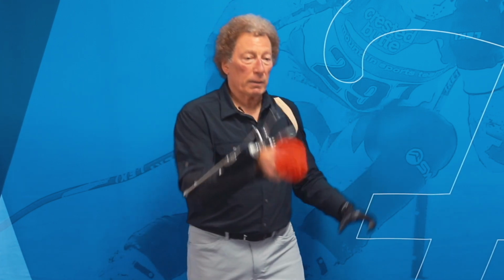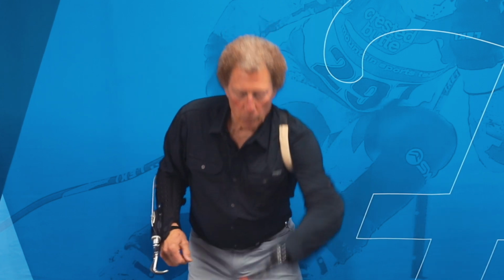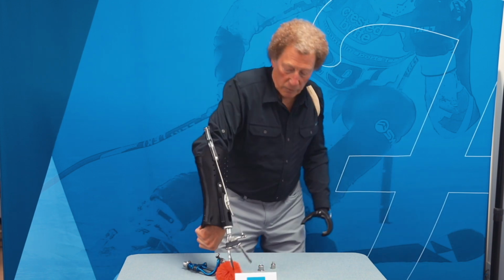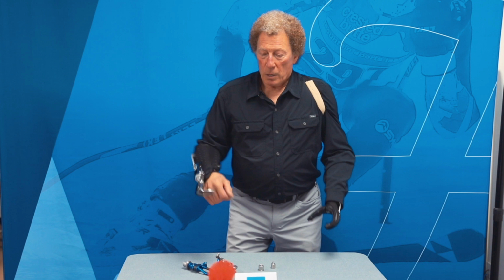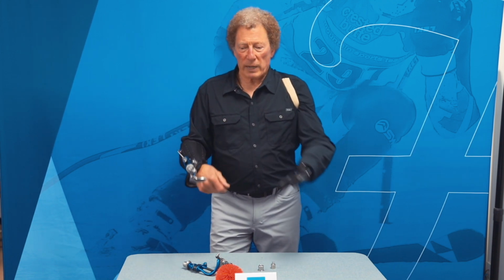It's pretty difficult to do something like this with a split hook. I'll try it, but it just doesn't follow natural pathways of reaching and grasping. Whereas the prehensor can reach and grasp, and I can grab things spontaneously. To do that with a split hook is just very, very difficult because the biomechanics don't work the same. With voluntary closing, the biomechanics are in harmony with the way your body naturally reacts. And with a split hook, they're exactly in reverse.